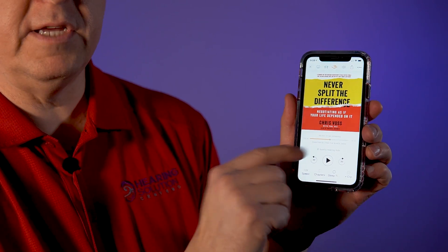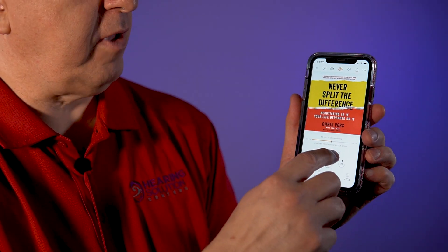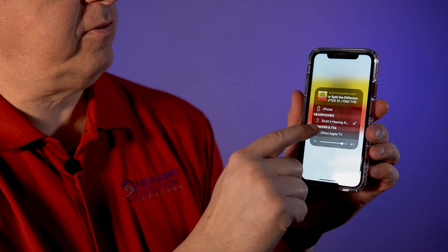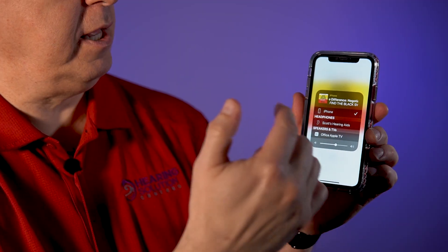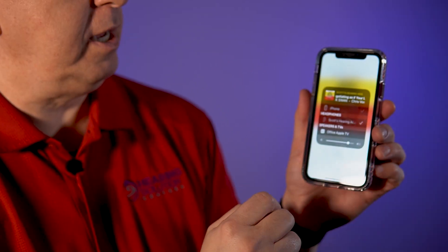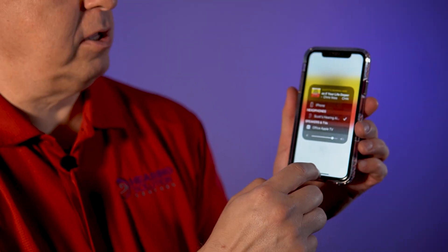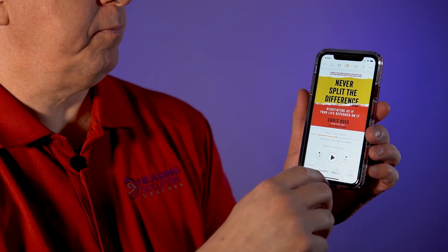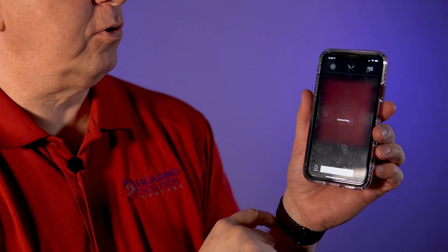Let's first show you the streaming abilities. We're going to look at one of my audio books — it's called 'Never Split the Difference,' just an audio book. You're going to see down below it says Scott's Hearing Aids. You see where it says iPhone or the phone itself and Scott's Hearing Aids — I could check mark it and listen through the speaker system, or I could be in Scott's Hearing Aids and adjust the volume of what it's streaming. I can hear it right inside my own hearing aids.